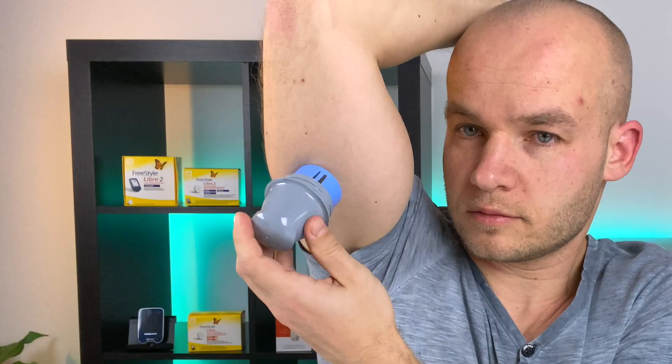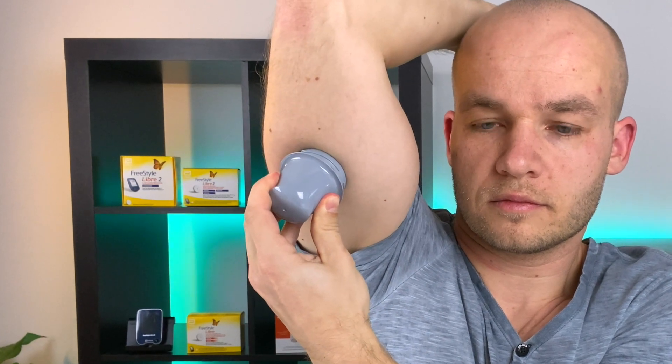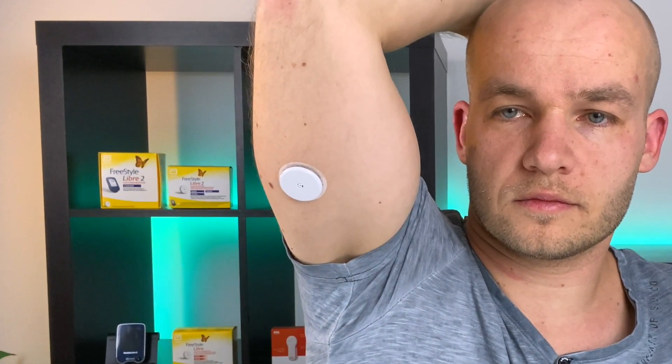Clinical studies show that the Freestyle Libre continuous glucose monitoring system is less accurate on the first day after application. What I do to improve accuracy on day one is apply a new Libre sensor 24 hours before the old sensor expires.